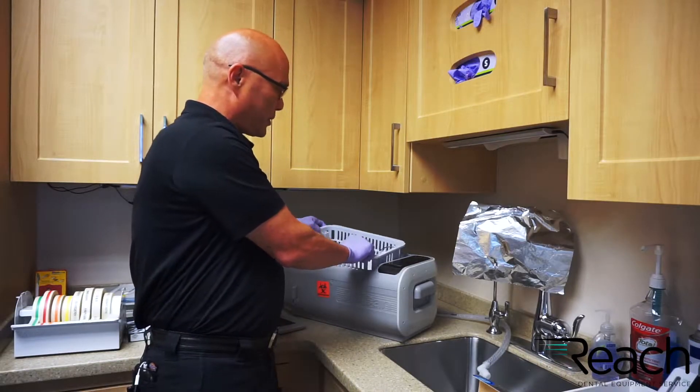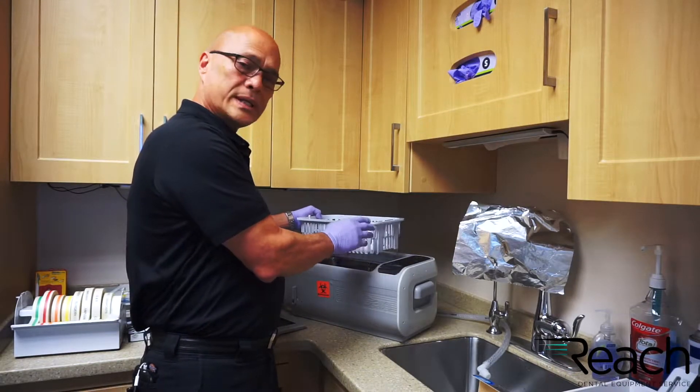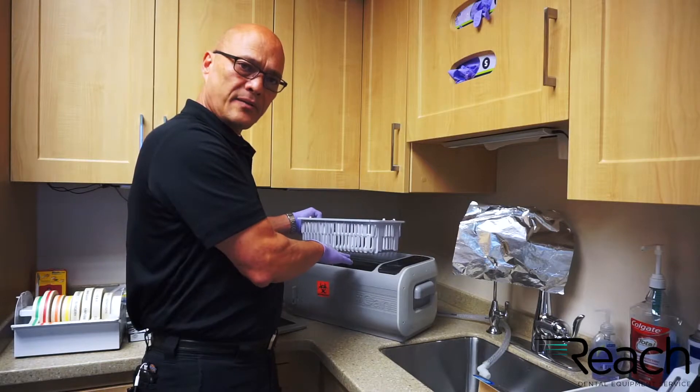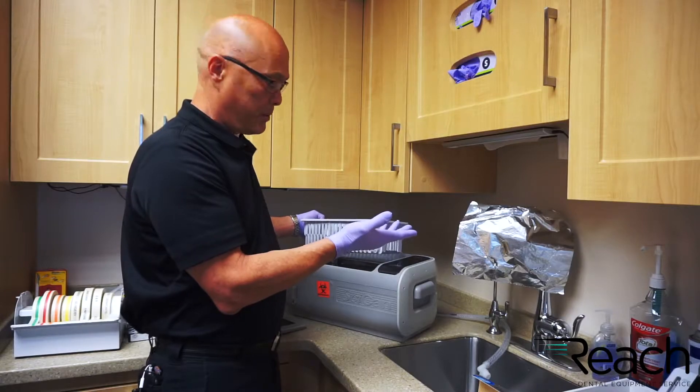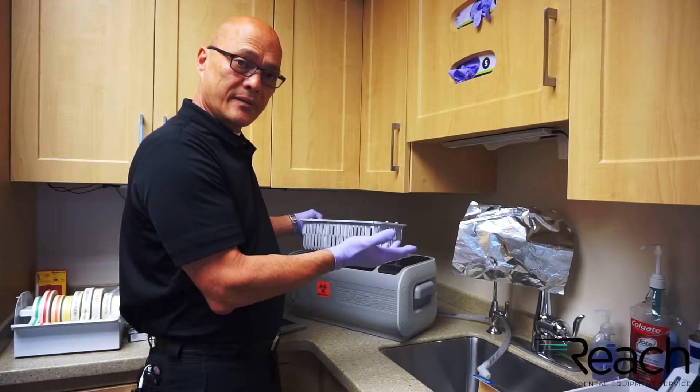Never use an ultrasonic without a basket. You don't want to set anything on the tank itself. It can actually wear holes in the tank, and once there's a hole in the tank you can't repair it, so it can cause a lot of damage.